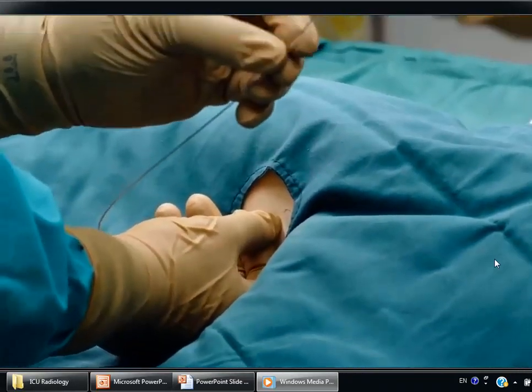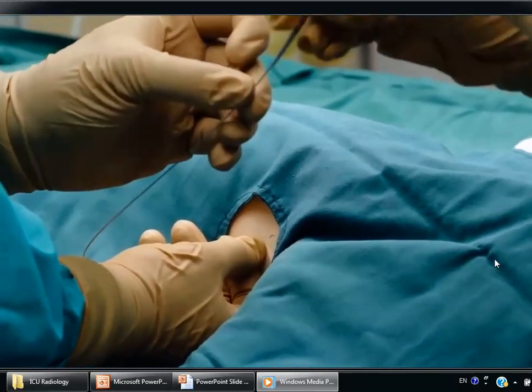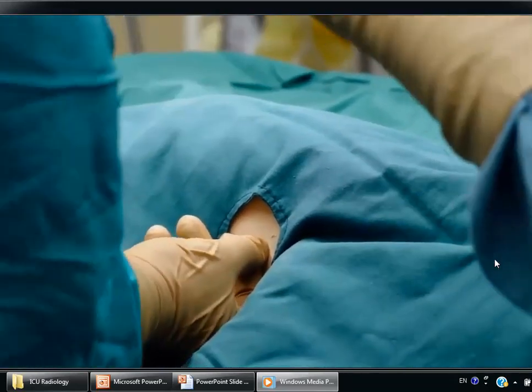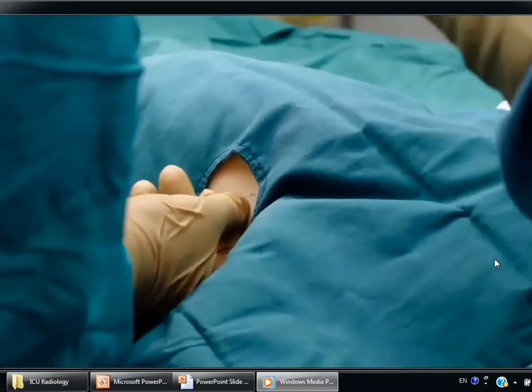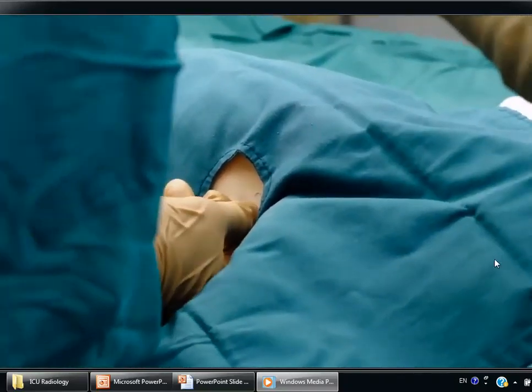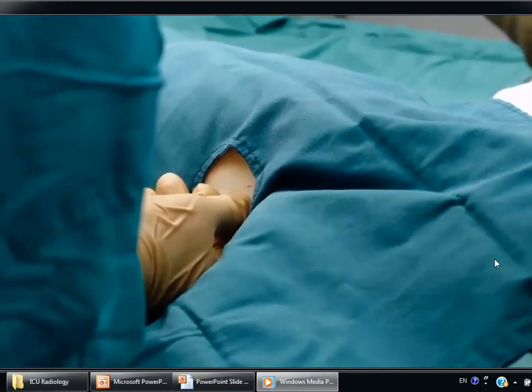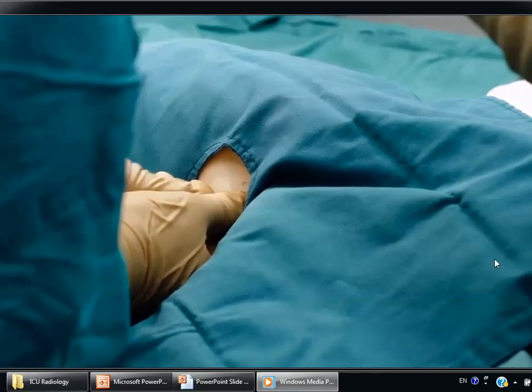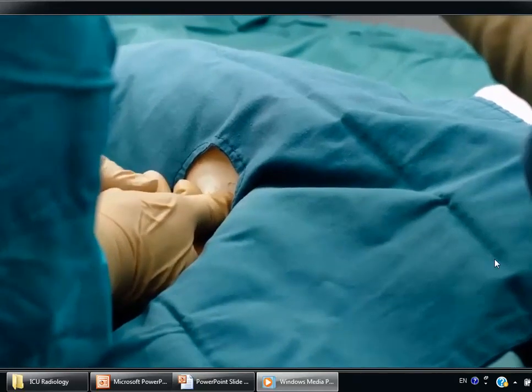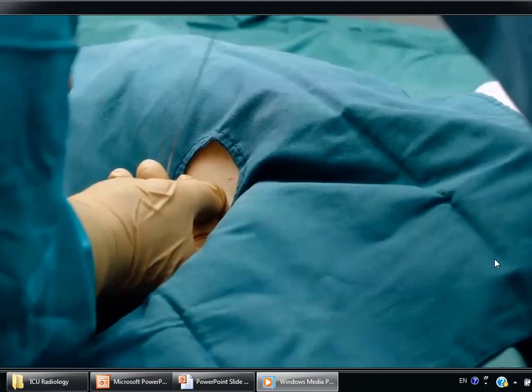Pass the first dilator along the wire, through the skin about 1 centimeter, angling anteriorly, then remove the dilator. The skin may require a small incision. It is important that the wire is held still at all times and not advanced or withdrawn. We are dilating. Then we remove it.